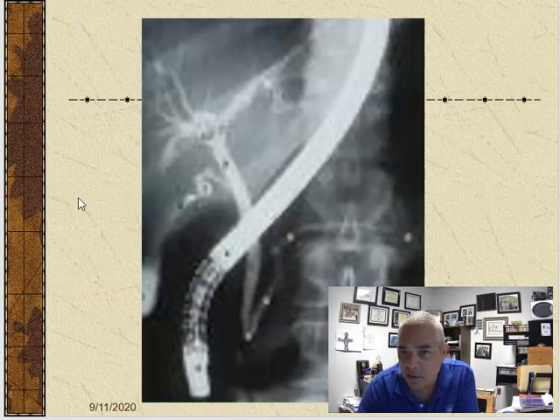Here's a little bit better picture. Okay, now in this one you can definitely see we've injected contrast, and here goes the duct of Wirsung going up into the pancreas. And then right here is the common bile duct, and you can see it's like, okay, well that thing shouldn't be that big. It's swollen. And then here goes that spiral valve that forms the cystic duct, and here's the gallbladder. And then up here is the biliary tree, and we have left and right branches.